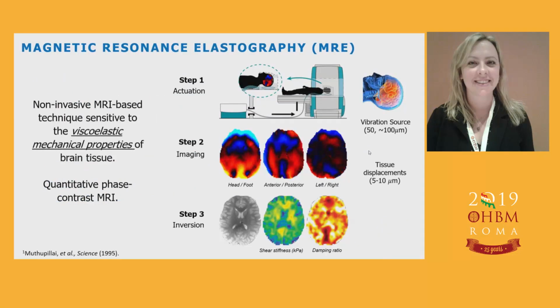So I'm going to be talking about how we can map the mechanical properties of the brain and the development of a standard MRE template. Maybe not everyone here is familiar with MRE. It's a non-invasive MRI-based technique that is sensitive to the viscoelastic or the mechanical properties of the brain.